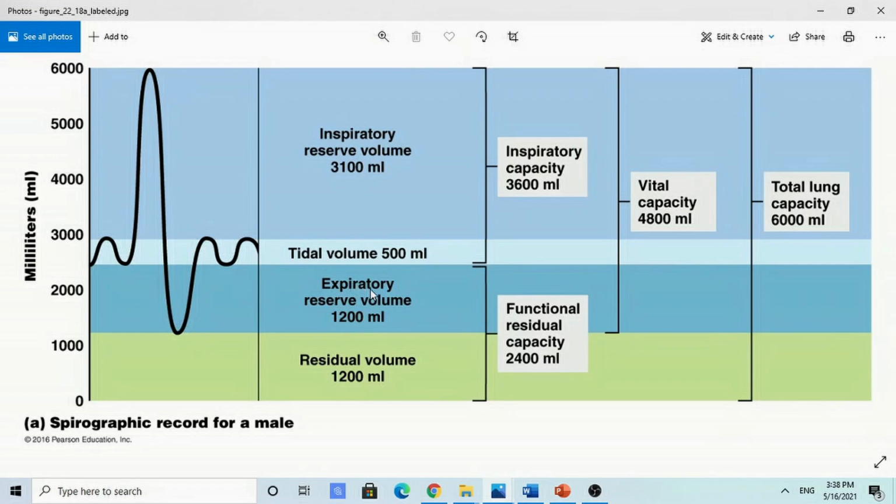By the way, during spirometry, when we measure the amount of air we breathe in and out, what we can measure is what we breathe out, because the patient is asked to breathe into the machine, into the spirometer, and that machine measures how much air was blown into the machine. But patients are not asked to breathe from the machine into themselves. So what we actually measure is what we breathe out. So then how do we find out how much we breathed in?